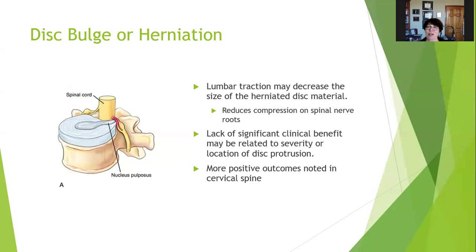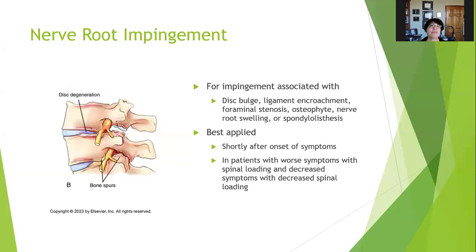Try it, and that might not be the treatment for them. Or maybe try some manual traction. If they respond positively, mechanical traction might be useful for them, or a home unit. And we'll look at some pictures of home units, and we have those in the lab as well.